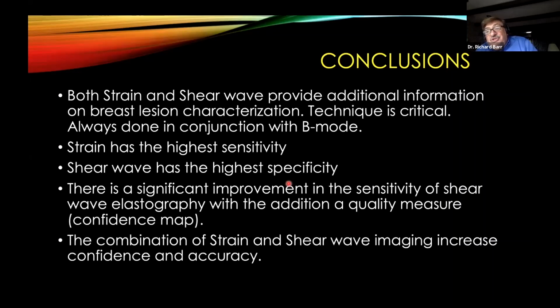Other organs, we're still learning, so it's very hard to give cutoff values. I would recommend that they look at the WFUMB guidelines for elastography for non-hepatic uses, which were published several years ago. It actually goes through the literature on all the different organs and gives you the most appropriate way to evaluate that.